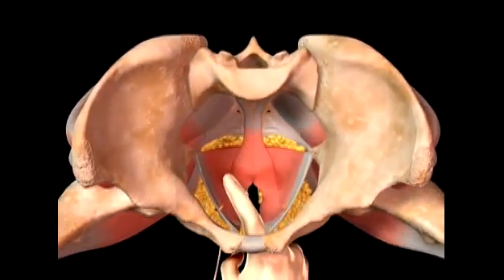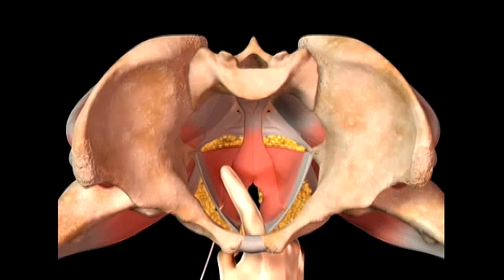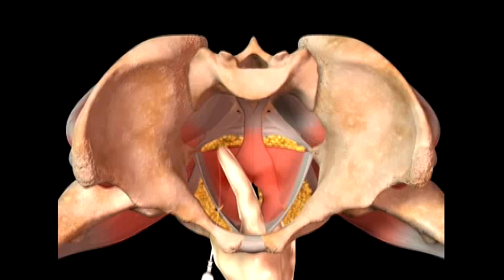The surgeon's finger in the dissected rectovaginal space is on the superior side of the levator ani muscles, whereby he or she can feel and direct the cannula-equipped guide passing on the underside of the levator ani muscles in the ischioanal fossa. The cannula-equipped guide passes through the subcutaneous tissues, then the dense fat of the ischioanal fossa to the underside of the sacrospinous ligament, approximately 2 cm medial to the ischial spine.